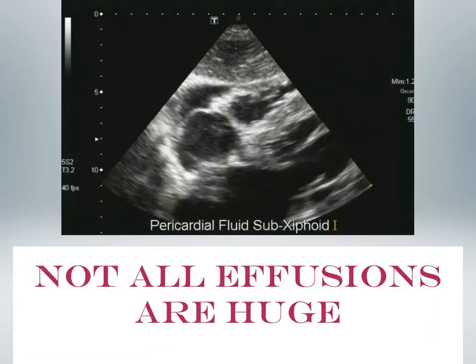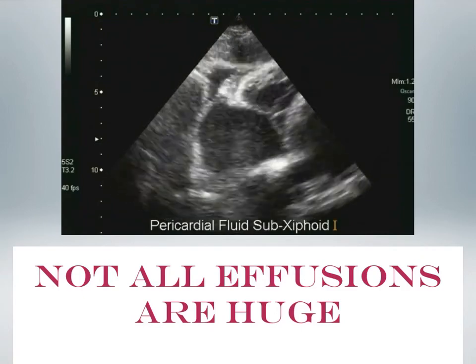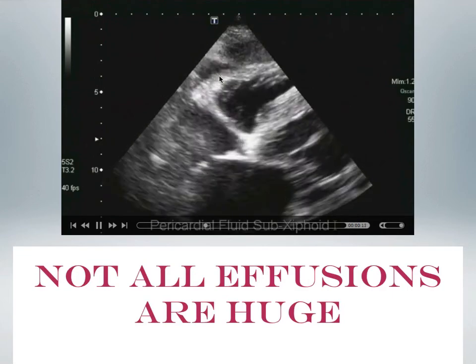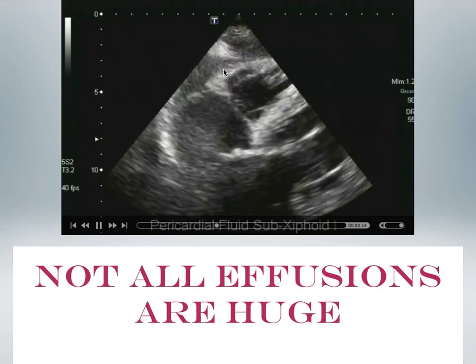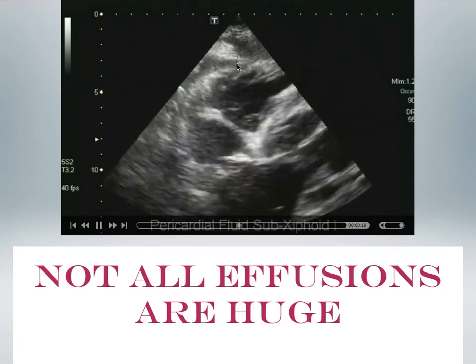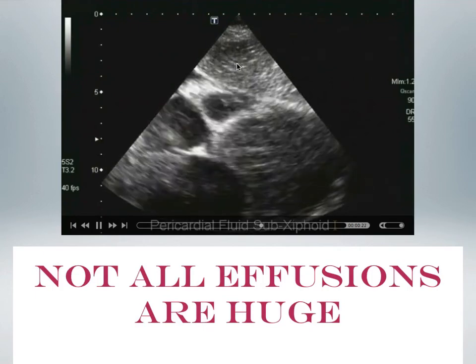And as a reminder, not all effusions are huge. So here's a small effusion, and this again, subcostal or subxiphoid. We see the liver on top. And an effusion is a normal finding, as long as it's small.